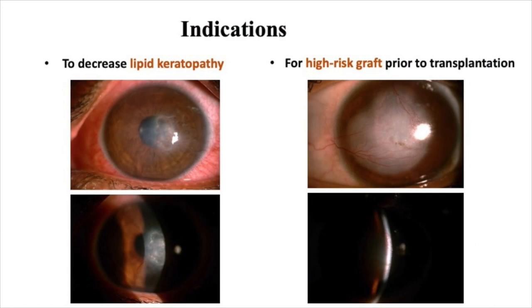Let us see a short video demonstrating the technique of FND and emphasizing the salient points.